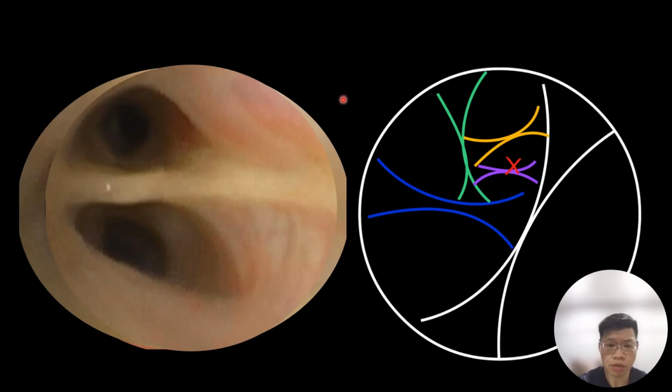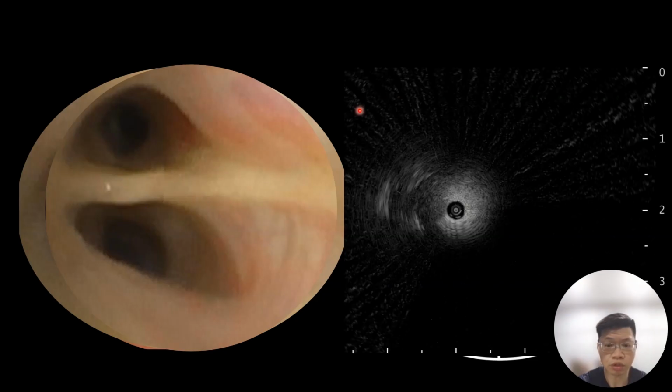During bronchoscopy, I also interrogated the lower hole to confirm that no radial image is to be obtained. Once our radial is in position, we know that if we push the lever of the bronchoscope upwards, which is in the thumb up position, the bronchoscope will extend downwards and press against this inferior wall so that the radial probe will be in contact with it, and we will find the image of the nodule, which is eccentric as shown.